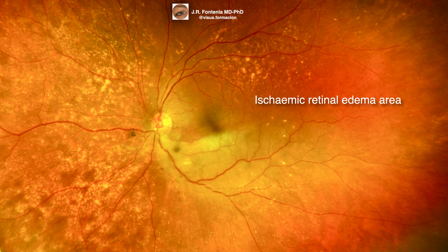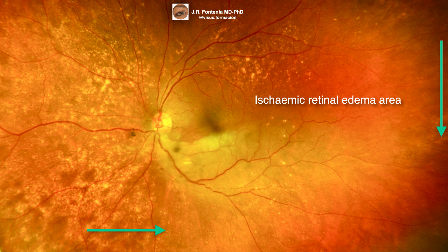In this white field retinography, we can see the area where the greatest amount of ischemic retinal edema is concentrated. Inferior and temporal to this area, we will also find acute parenchymal ischemia, although the retina is not so edematous. The layers of the retina where edema accumulates are thinner the farther we are from the posterior pole — being thinner, they retain less fluid and show less edema — but the entire inferior temporal quadrant will be functionally affected.